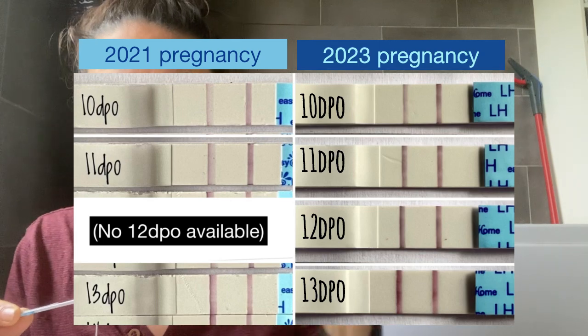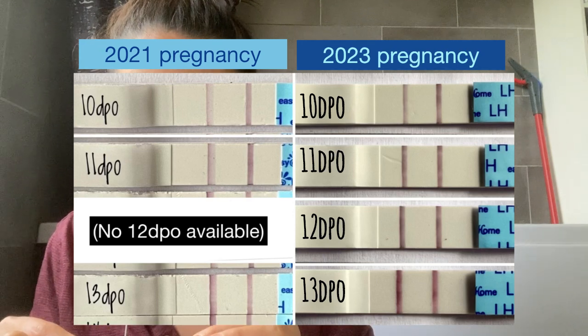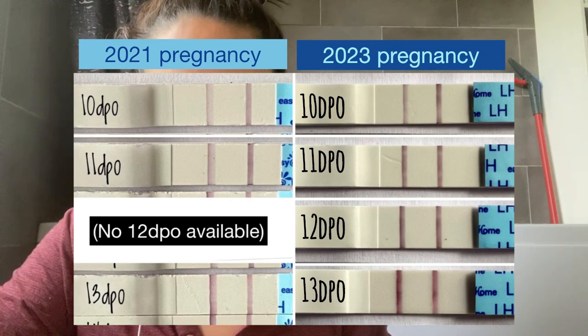I will be putting up, obviously, picture comparisons here so you guys will see. This gives me hope though. That is good. The blue one-step test and the OPK are both showing a clear increase over yesterday, which is good. I just want, it doesn't need to be dark. I just want it to be somewhat noticeably different from what it's been the past 2 days.